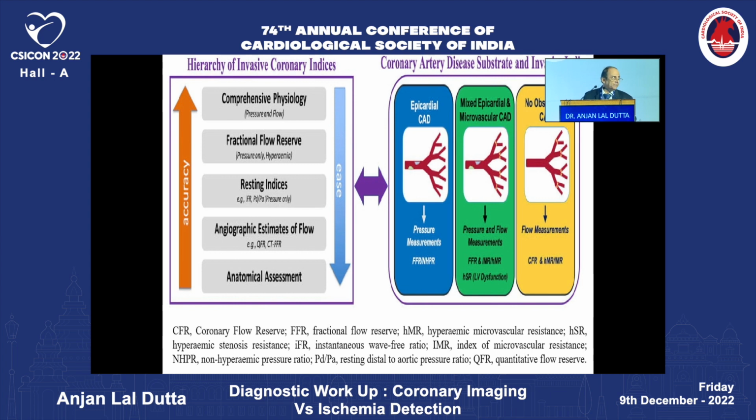If you look at the clinical aspect of the structural disease, you can see a white patch on the main artery. In the coronary artery disease subset, there may be pressure measurement like FFR in epicardial coronary artery disease.